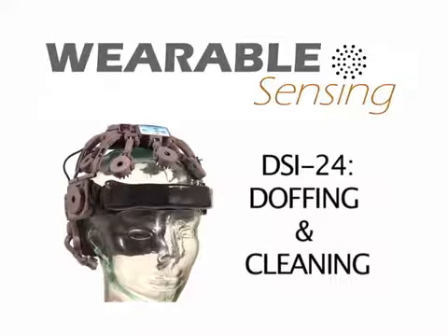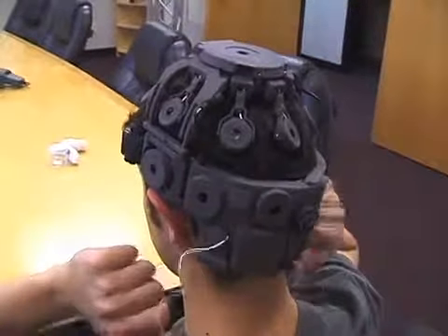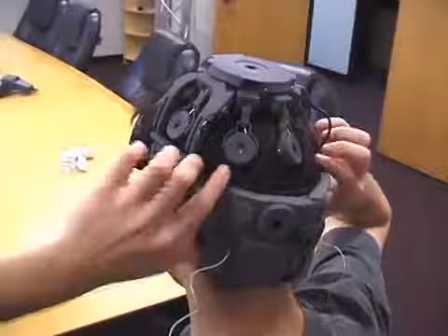This video shows the doffing, cleaning, and maintenance procedures for Wearable Sensing's DSI-24 EEG headset. Removing the headset is easy. Simply pull out the adjustment knob, remove the ear clips, then lift the forehead strap over the brow and slide the headset off.